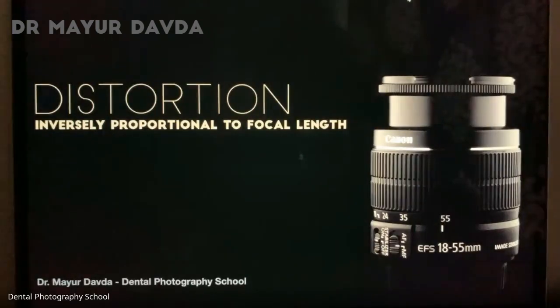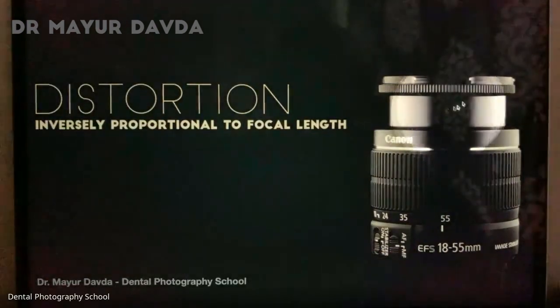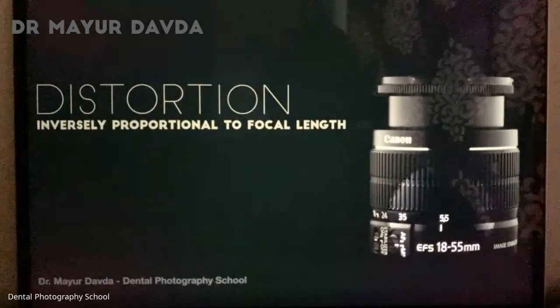So what lens do I suggest? What lens is going to give lesser distortion? Any lens which has a focal length around 85 or above is going to give you lesser distortion and hence better images. So where is focal length written on the lens? This is the focal length. The focal length over here is 18-55, and this is not a great lens for documenting.